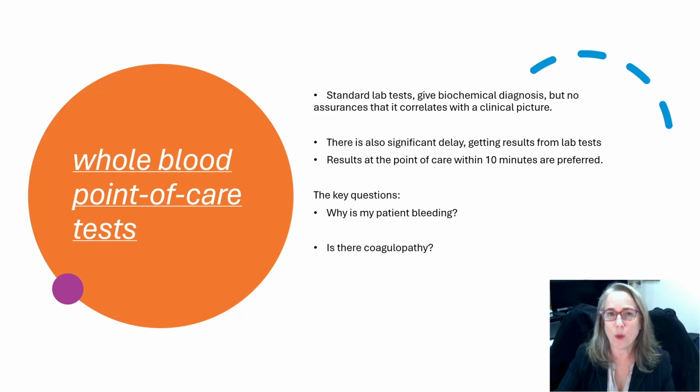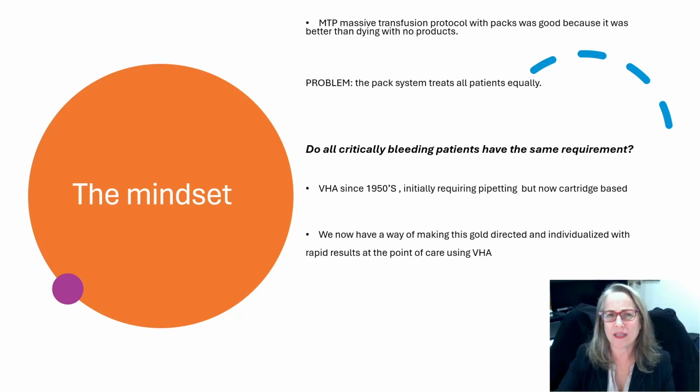The key questions when you are at the point of care in a critical bleeding scenario as the boss are, why is my patient bleeding? And is there coagulopathy? We want to solve these problems and get a good outcome for our patients, and we need an answer quickly. So this is the mindset. The Massive Transfusion Protocol, it was good, it had its time, it still definitely has a place, particularly around the world. However, here in Sydney, massive transfusion protocols with packs treat all patients equally. And what we don't want to do is treat all patients equally.